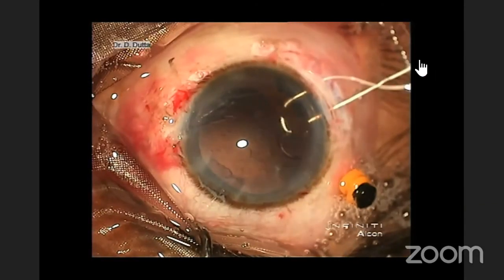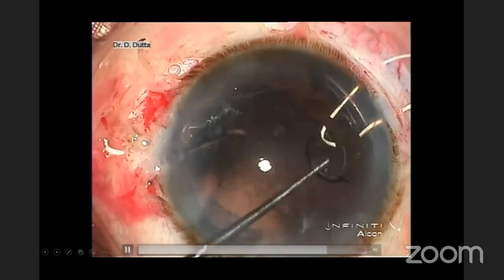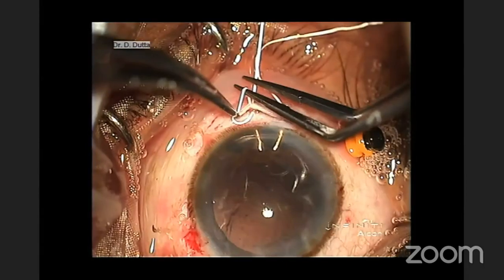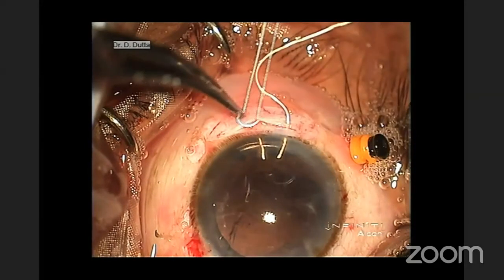The segment is aligned inside the capsular bag. The combination of the segment, CTR, capsular bag, and the iris is drawn to the periphery and fixed to the sclera by titrating the knot.